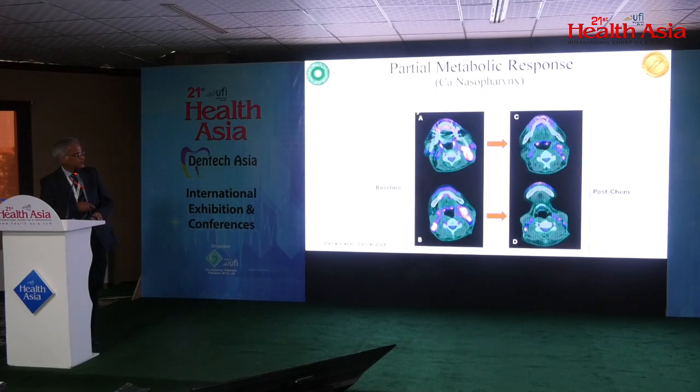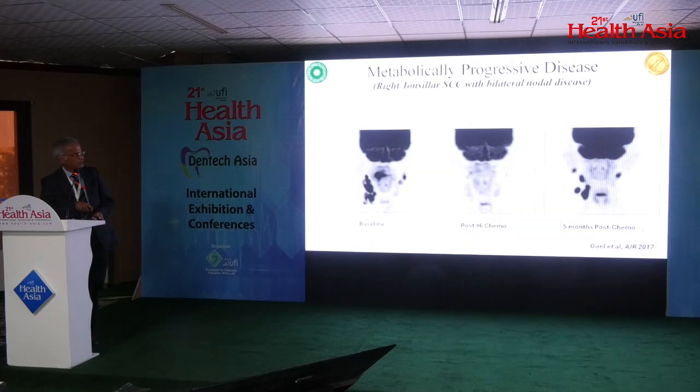Another case of the nasopharyngeal carcinoma, we can see that there is hypermetabolic bulky disease predominantly on the left side, but after chemotherapy, there is a significant reduction but not complete normalization. So this is a case of the partial metabolic response.